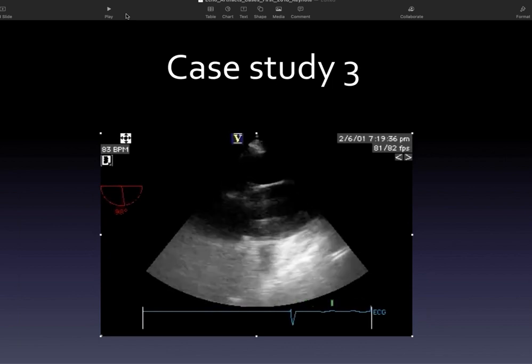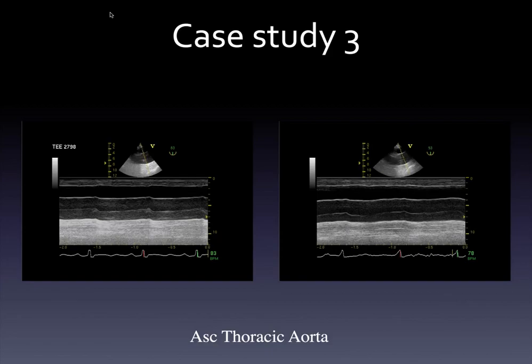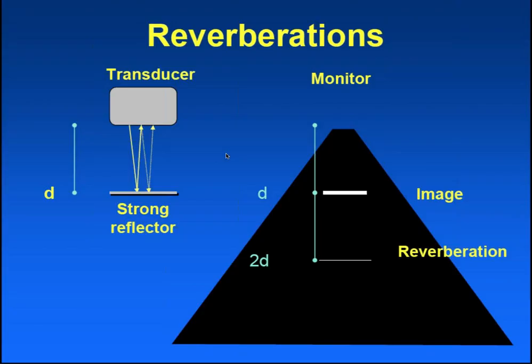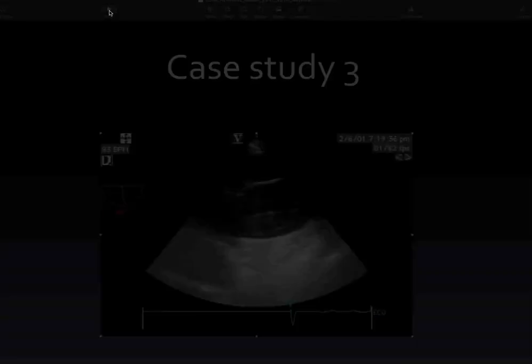More pictures is always the right answer. Yeah. I'd just put color on it and see what the color does. Very good. Okay, so I actually did something else instead. Let's see if I put the color on in this case. No, I didn't. So what I did is the color actually does not respect it, and it goes right through it. But what I did instead is I did this, which is actually I started measuring things.